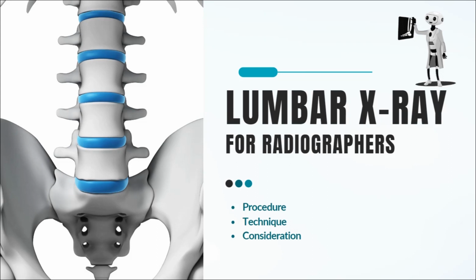Hi everyone, here we are again with another tutorial for X-ray workers. In this video, we will talk about the lumbar spine X-ray procedures and technique, and I'm sure by the end of this video, you will learn something new and be able to perform lumbar X-rays in the most proper way.